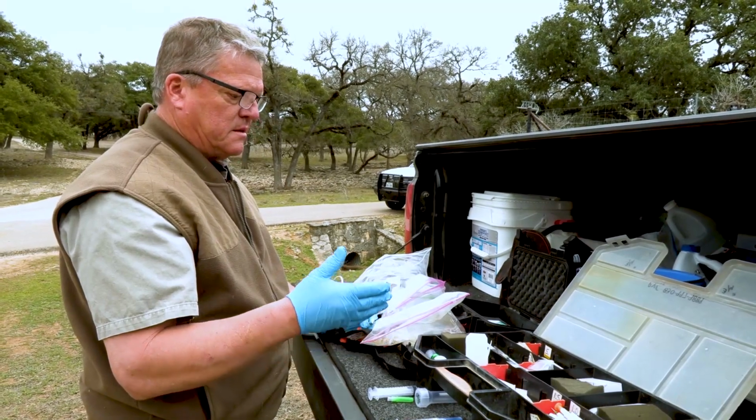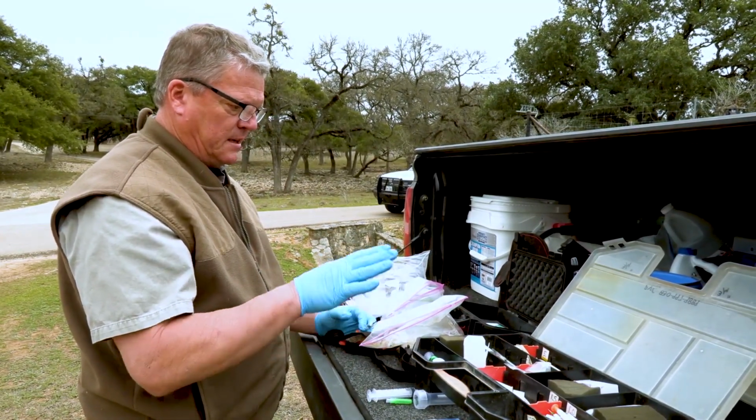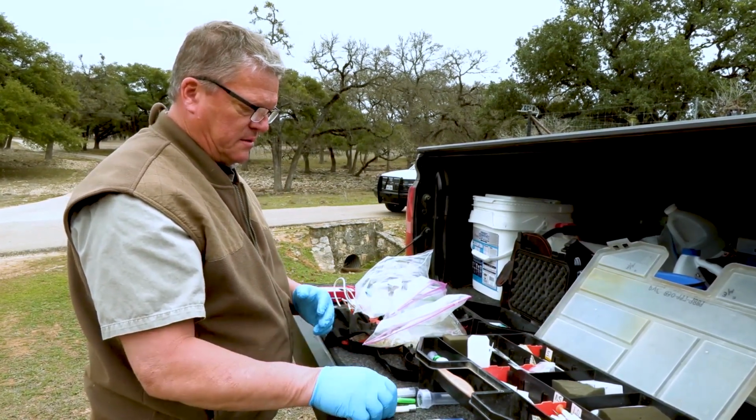If the dart misses or if there's a bad detonation, for any reason I need access to these drugs, it's always going to be with us. And so we have the dart and the reversal ready to go.